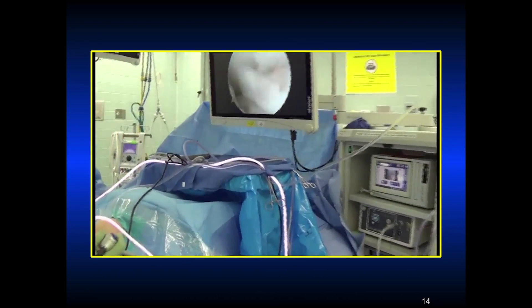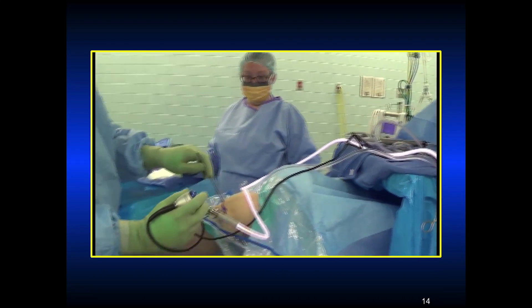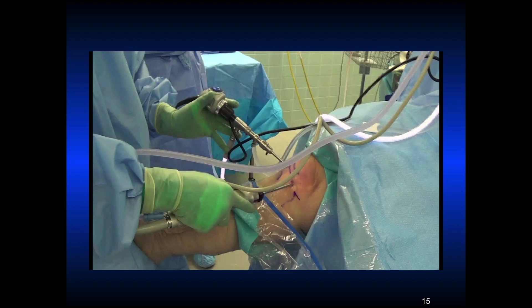There's the ACL. Now I'm going into the medial compartment. The scope can be switched to the medial portal, and now the working portal is lateral. If you have to work in the lateral compartment, such as getting to the posterior horn of the lateral meniscus, switch your scope medial. If you need to get to the anterior horn of the medial meniscus, this is also the way you do it — you can come in more perpendicular across the knee joint with your shaver or biter to work on the anterior horn. So think about switching your portal depending on what your findings are.